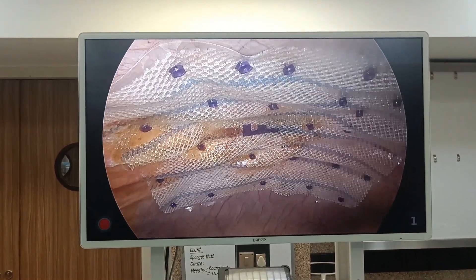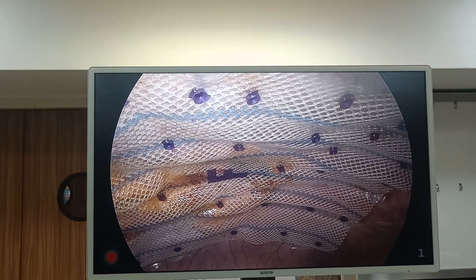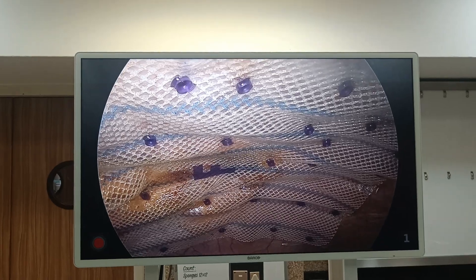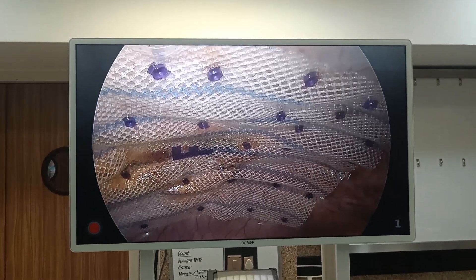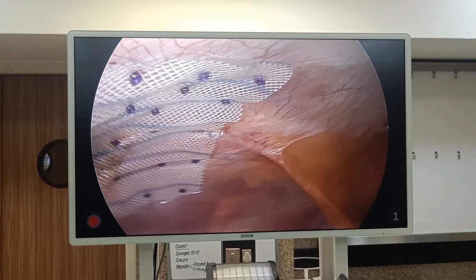That blue-violet absorbable thing you are seeing is actually tacks — these are screw-like structures which help in preventing and holding the mesh against the abdominal wall.